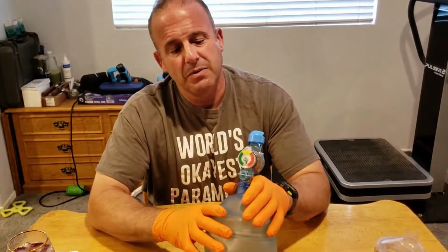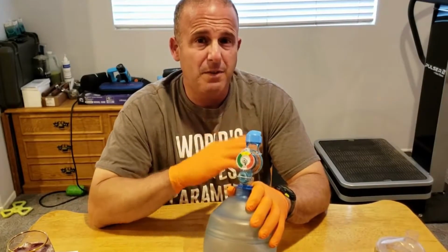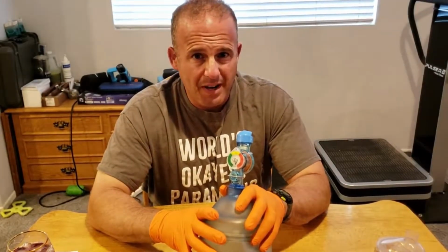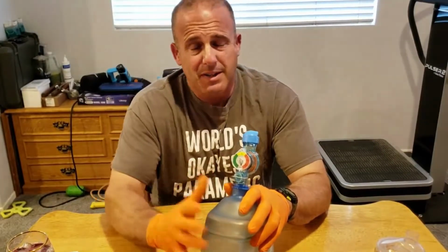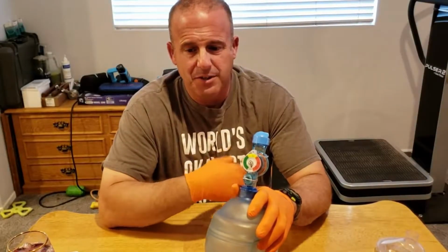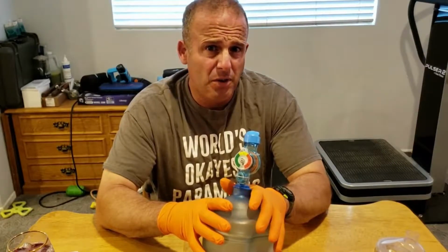Well, we've since known that when you try to bag someone, you almost always push air into the stomach. The higher the pressure, even with a patent airway, you'll also get air down their esophagus into the stomach. Why? One reason is when people are dead, the sphincter at the top of the esophagus, or the one that leads into your stomach, the muscle is also weak and it's not working. So no matter what you do, you wind up pushing air into the stomach. As you charge the stomach with air, like a soda can with pressure, you eventually will cause the person to regurgitate, puke, compromise the airway, make a messy call overall.